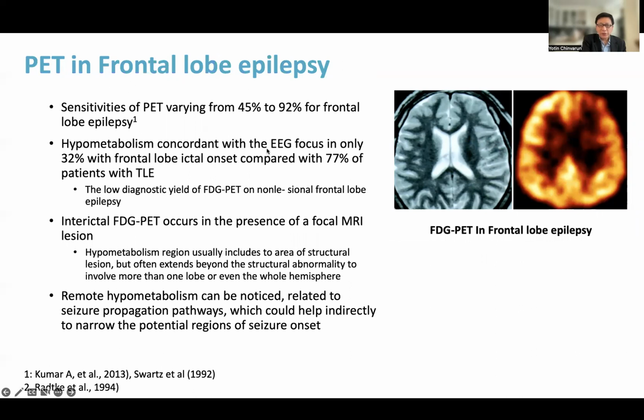Hypometabolism concordant with the EEG focus is found in only 32% of patients with frontal lobe ictal onset, compared with 77% of patients with temporal epilepsy. The low diagnostic yield of PET can also be found in non-lesional frontal lobe epilepsy.